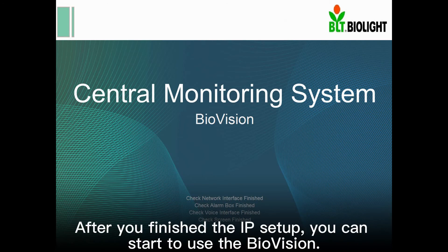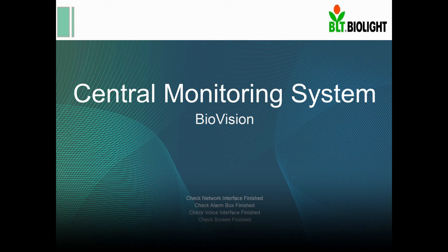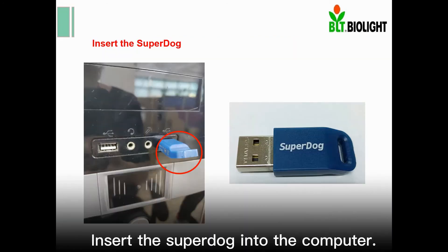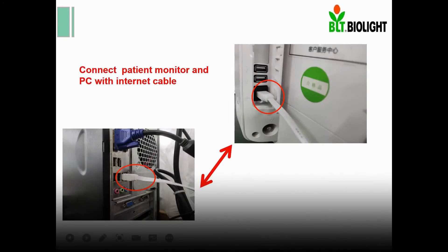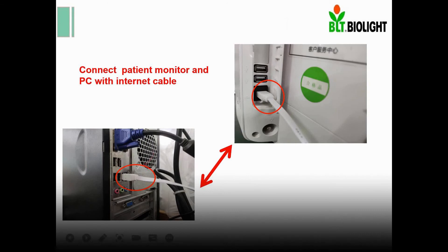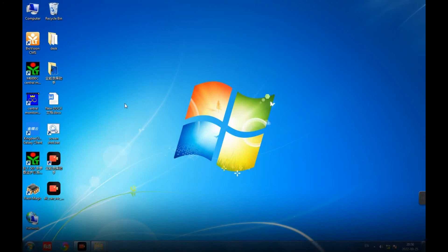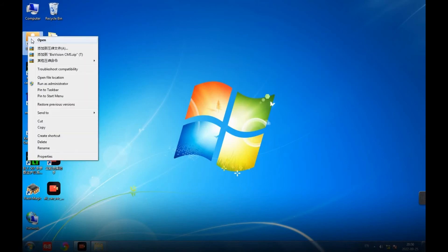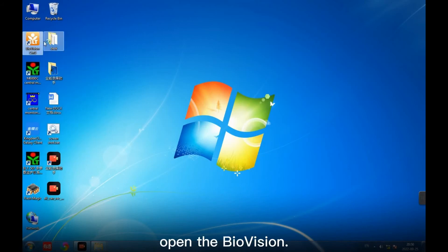After you finish the IP setup, you can start to use the BioVision. Insert the SuperDog into the computer. Connect patient monitor and PC with internet cable. Open the BioVision.